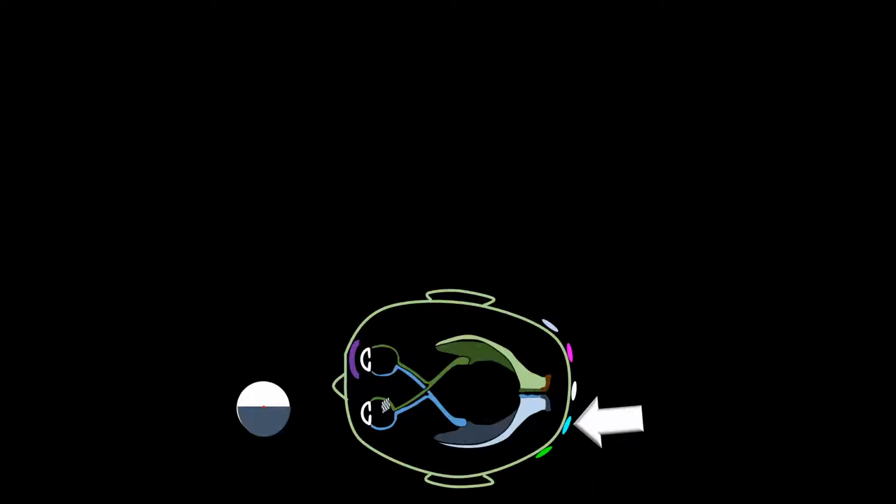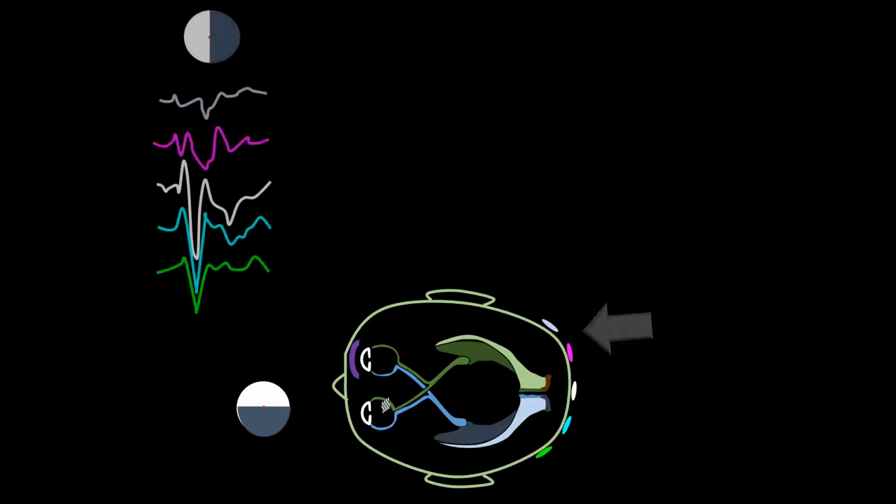These electrodes will have the NPN complex, whereas in the contralateral electrodes, that is, in the right occipital and right temporal electrodes, we would find less well-defined waves forming the PNP complex. In this frame, I have represented the waves I just mentioned matching line colors to electrode colors.